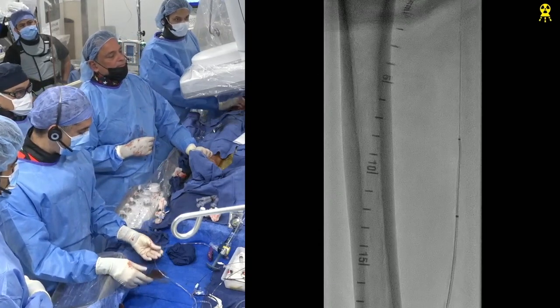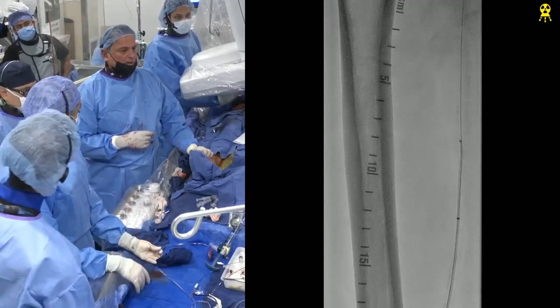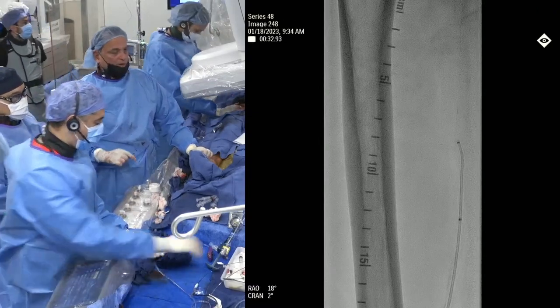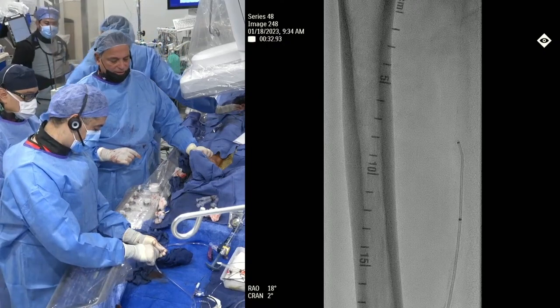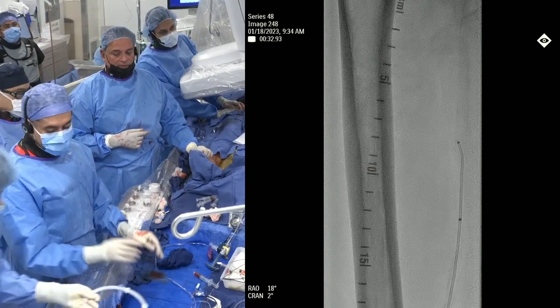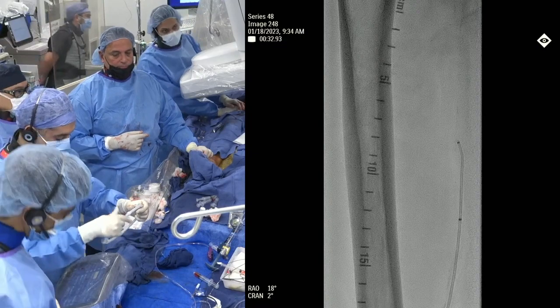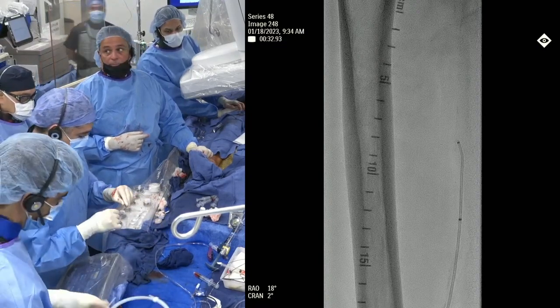We're definitely across. Okay, let's take a Spartacore now. Perfect. Now let's save that. So we're going to put a Spartacore up into the common femoral. The question here for Ajit is, should we put it into the graft or doesn't it matter? I'll put it into the graft, because that's where the inflow is. The native vessel doesn't matter. The tip of the shockwave is definitely going to project a little bit into the graft.